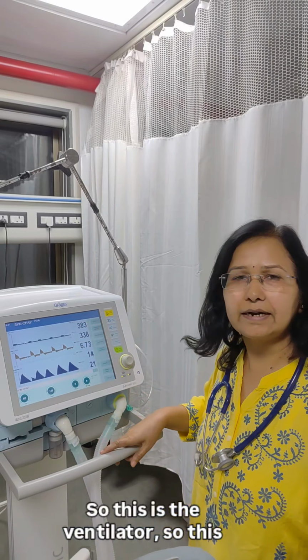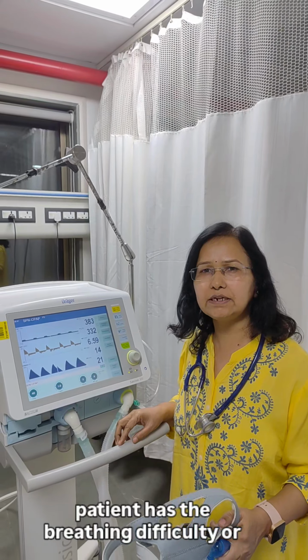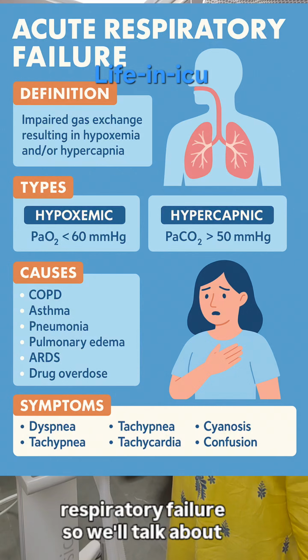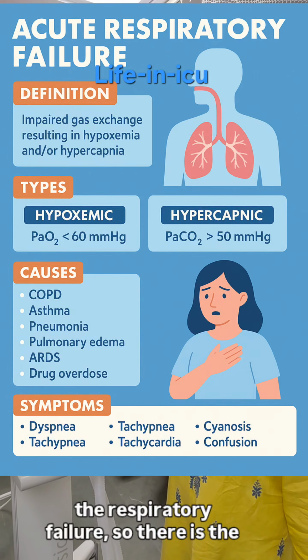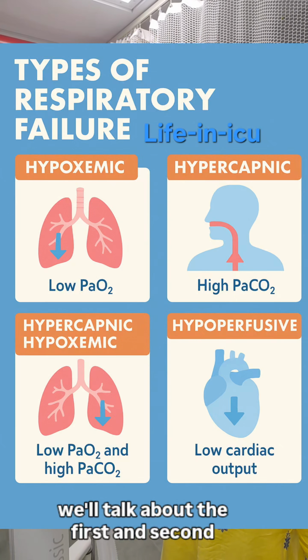So this is the ventilator. This ventilator helps the patient whenever the patient has breathing difficulty or respiratory failure. So we'll talk about respiratory failure. There are 4 types of respiratory failure. Mainly we'll talk about the first and second type.